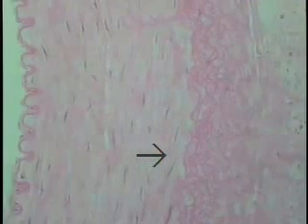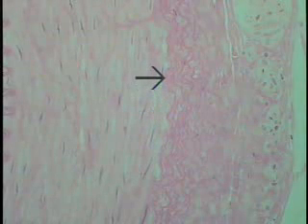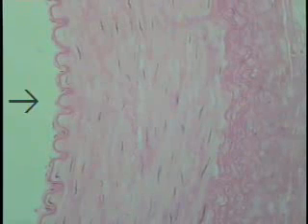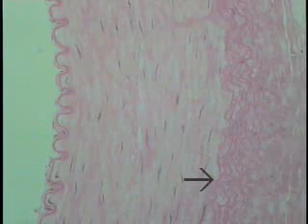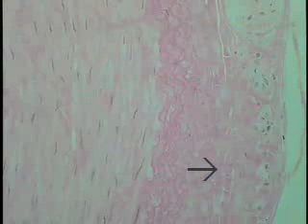As one courses through the vessel, this would be the region of the external elastic lamina. More often than not, rather than one thick, robust single membrane, as is true of the internal elastic membrane shown here, the external one often appears frayed and may consist of three or four of these elastic laminae unraveling. And this forms the boundary from this point on to the exterior surface, consisting mainly of collagen, though a few smooth muscle cells with longitudinal orientation can on occasion be found. It's mainly a connective tissue covering, this being the tunica adventitia.